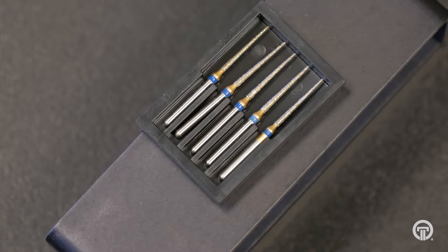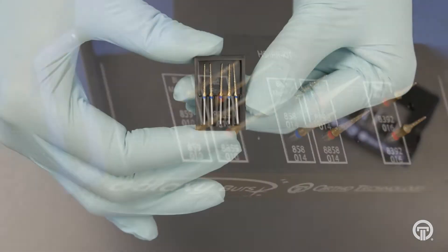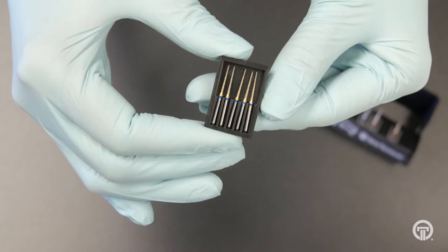They come available in a five pack or a kit with burr block included. Call your rep today for more information on this product and specials.